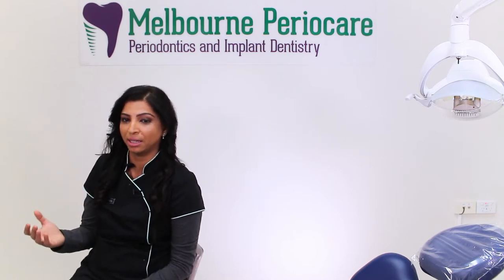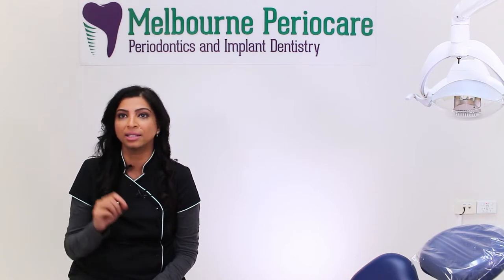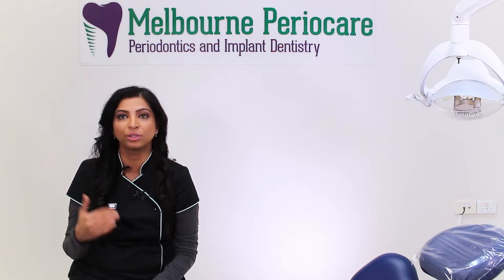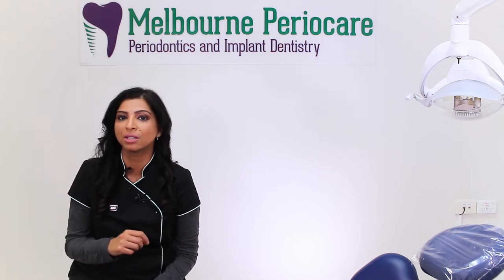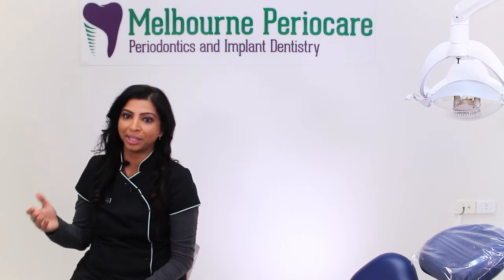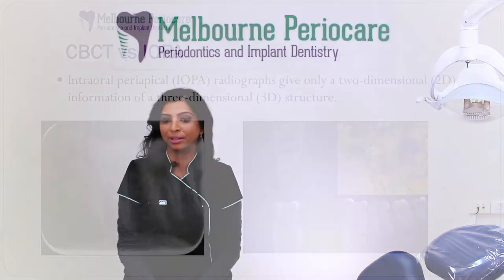And that CBCT enables a precise estimation and categorization of furcation involvement, as well as visualization of the root morphologies with root proximities or root fusions. So here is a very, very good way of looking at furcation involvement. Another study in 2016 found out that cone beam CT gives a very accurate diagnosis of furcation defects, especially in advanced periodontal cases. So how does CBCT fare as compared to traditional intraoral periapical X-ray?